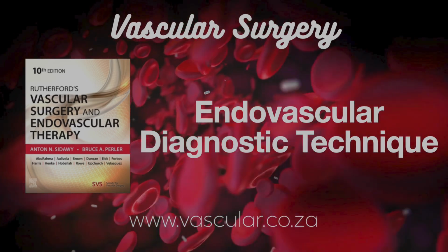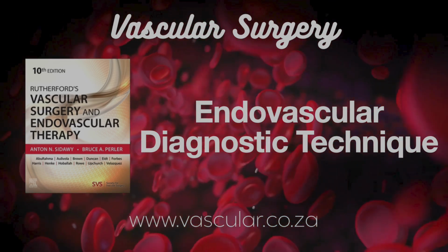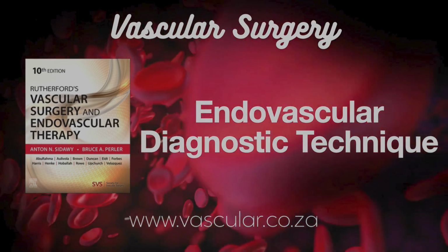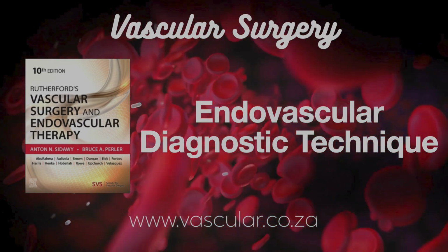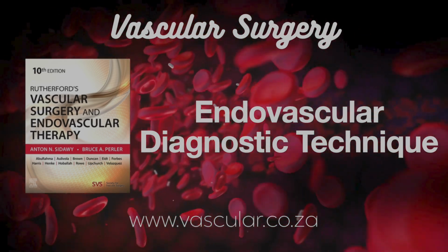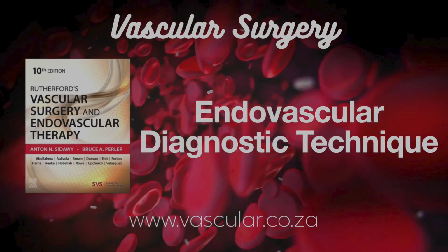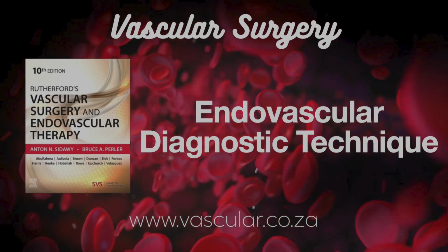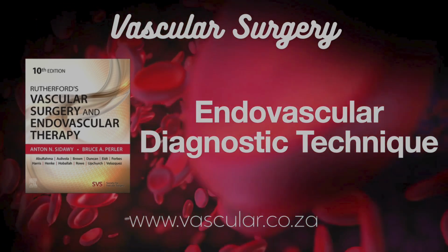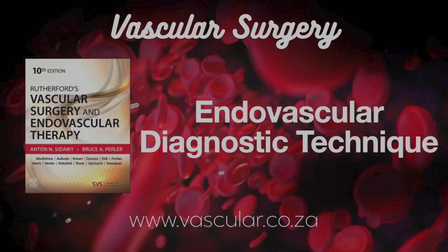Vascular access sounds simple enough, maybe. Well, it's the fundamental starting point for pretty much every endovascular diagnostic procedure. Makes sense. It all begins with percutaneous access, which basically means getting into the arteries or veins through the skin. And for arteries, I hear the common femoral artery, the CFA in the groin, is like the main entry point. Overwhelmingly so, yeah. Especially when we're looking at the aorta, the iliac arteries, or down into the legs.